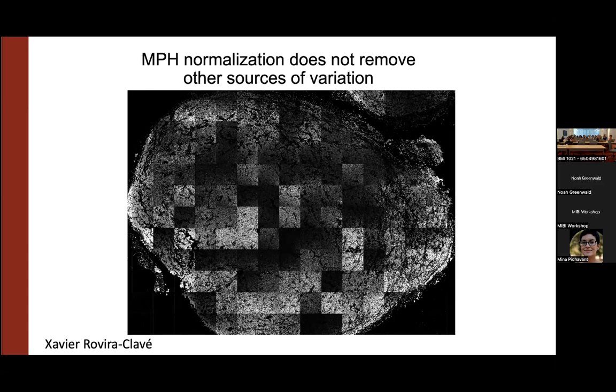So they have started looking at other approaches, some estimating the true signal based on an unchanging marker, more similar to previous approaches, because it doesn't appear to be driven by detector sensitivity. This is something that we're troubleshooting now, but just as a heads up, if you start doing large tiled images, right now it appears that there's some sort of systematic issue with the way the instruments are set up that results in these intensity changes.